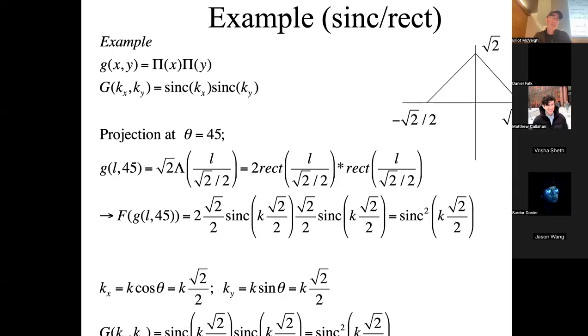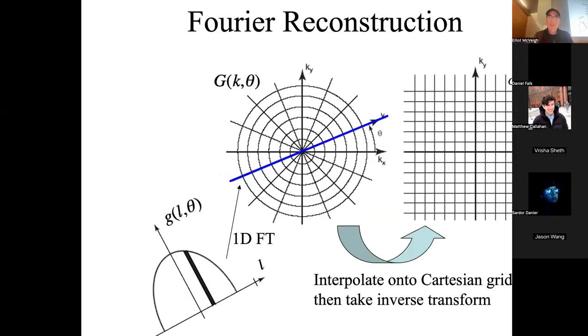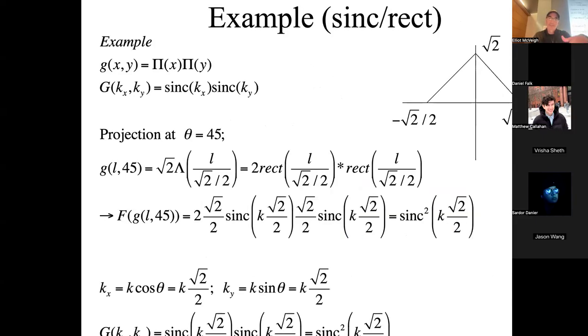And we can compute the one-dimensional Fourier transform of that triangle function and see if that is what is in the 45-degree direction for the Fourier transform of the 2D rect function, right? That's the demonstration that the projection slice theorem works for this 45-degree angle. So you can do that too. It's just a lot of algebra to get through it, but it works.